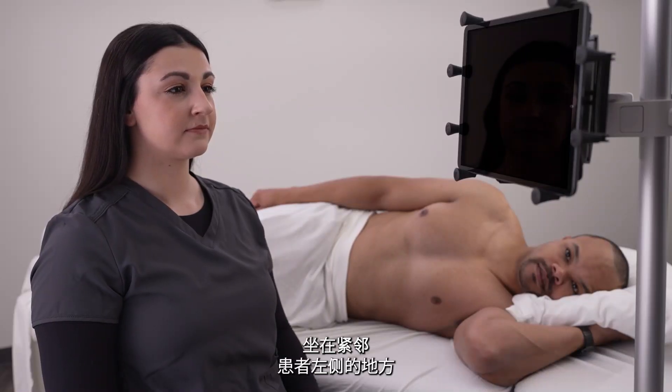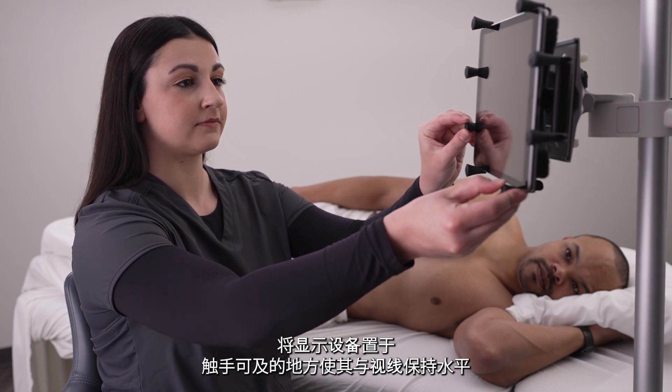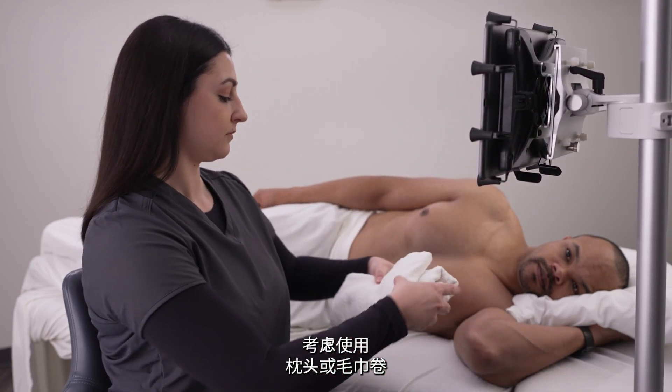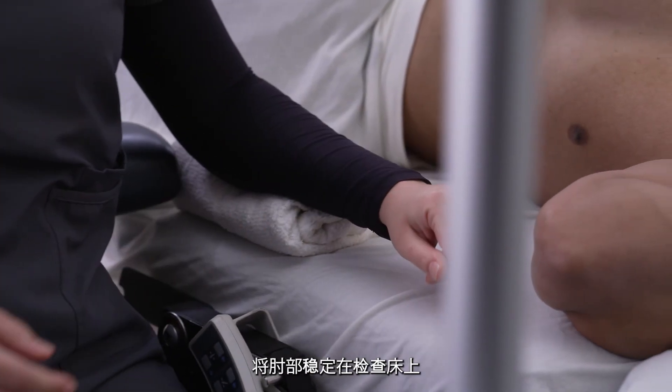Sit next to your patient on their left side. Place your display device within reach and at eye level. Consider stabilizing your elbow on the exam bed using a pillow or rolled-up towel.